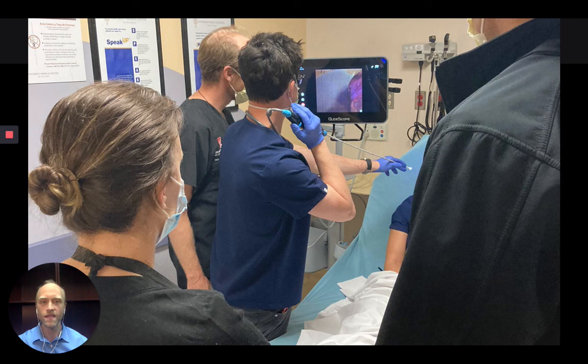After performing several nasopharyngoscopies, you will have the required skills to perform an awake intubation. To further gain competence, I recommend performing an awake intubation on a patient who is not predicted to be difficult. If for some reason you struggle with the awake approach, you still have all your other airway options available. However, I predict you will be surprised at how well the attempt will go. After completing a handful of awake intubations on patients with normal anatomy, you will be competent and, more importantly, confident when the patient with abnormal anatomy presents to your ED.